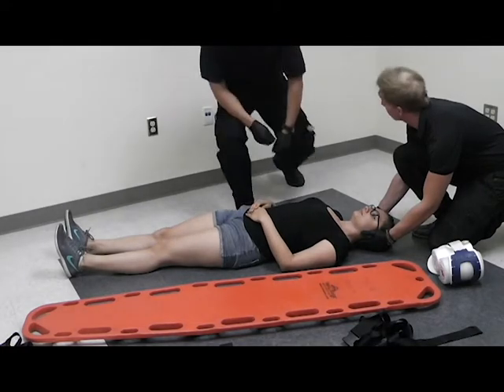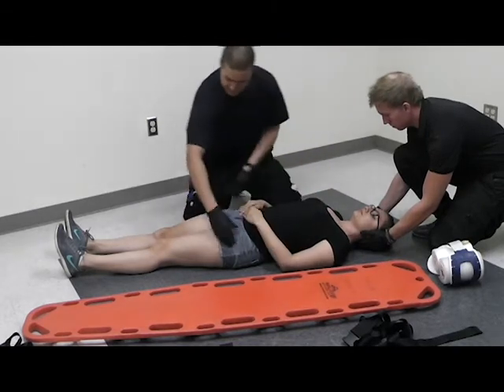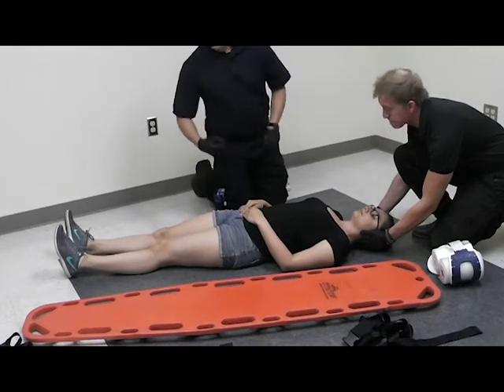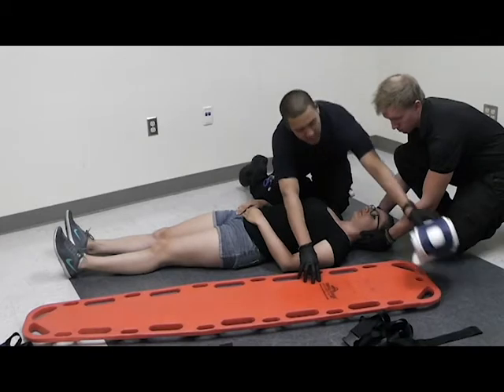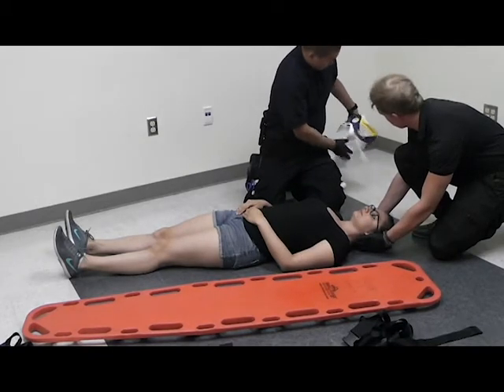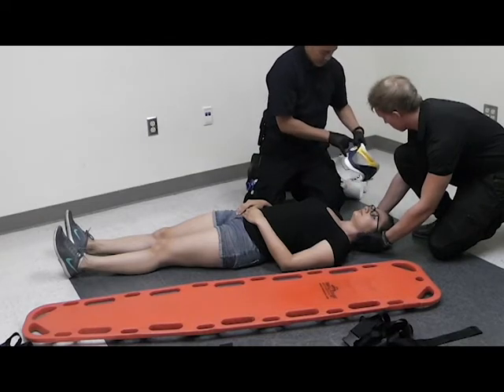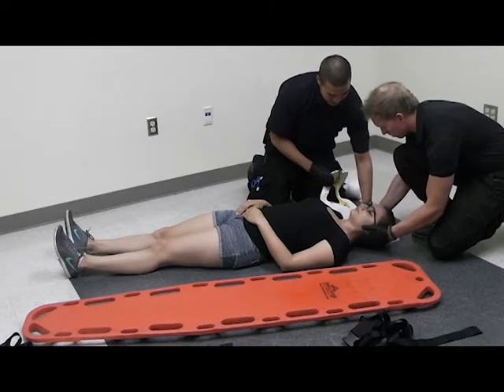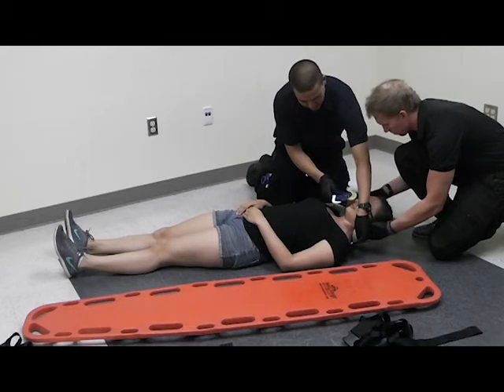At this point, I'm going to do a full head-to-toe check, checking for any deformities or anything else. If none are indicated, I can continue on with my cervical collar application. I'm going to take my collar, properly size it to my patient, slide it underneath, and apply my collar.